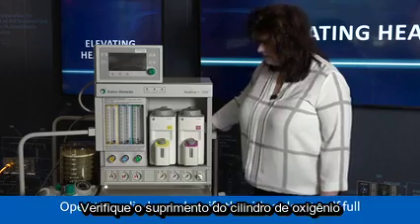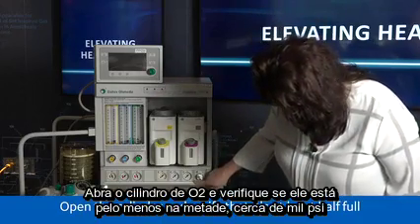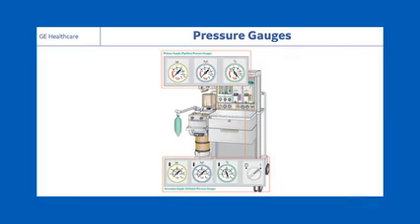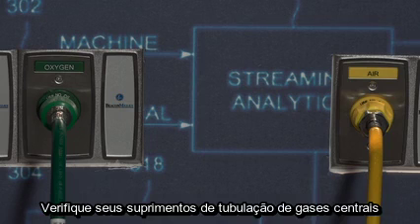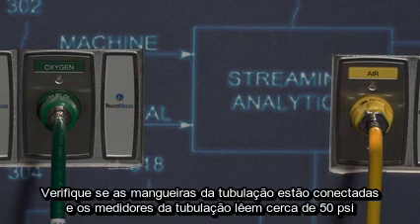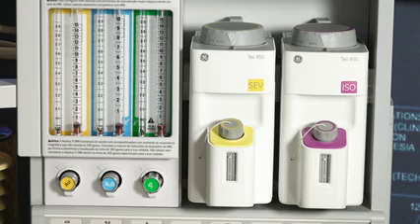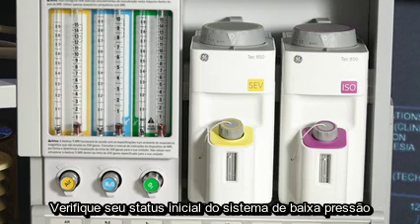Check oxygen cylinder supply. Open the O2 cylinder and verify that it's at least half full, about 1000 psi. Close the cylinder. Check your central pipeline supplies, ensuring the pipeline hoses are connected and pipeline gauges read about 50 psi.